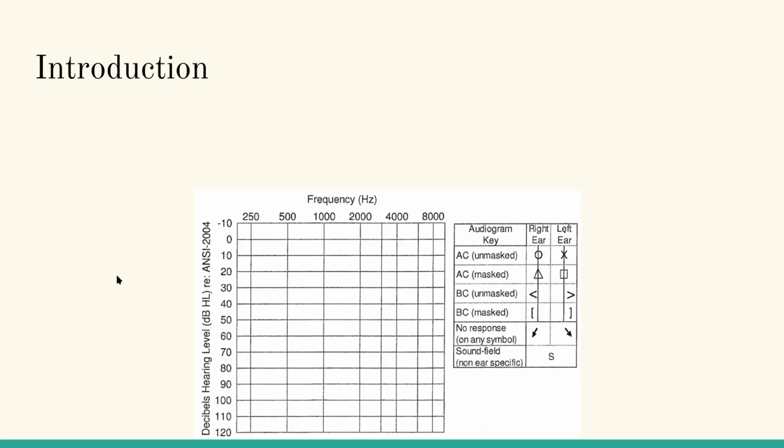First, we want to show you just a regular audiogram. This is a blank audiogram. Don't worry about the ANSI standard listed on the side there. It doesn't change much over the years. This audiogram just happens to be from an older ANSI standard, but like I said, the ANSI standard really doesn't change much over the years. It's very minimal changes. And for our purposes here, it's not going to have any impact whatsoever.